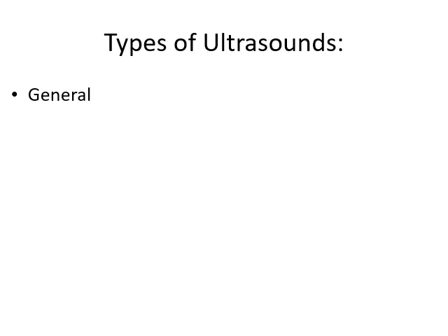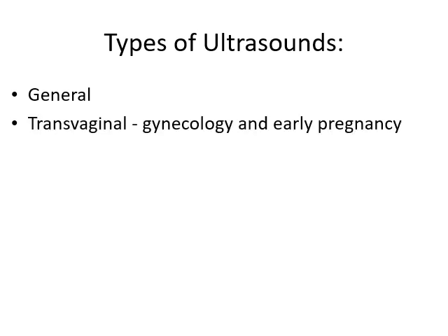Now you can have a transvaginal ultrasound. So they will put the ultrasound probe up inside you, and they'll use that for gynecological problems, or if they're looking at a very, very early pregnancy.